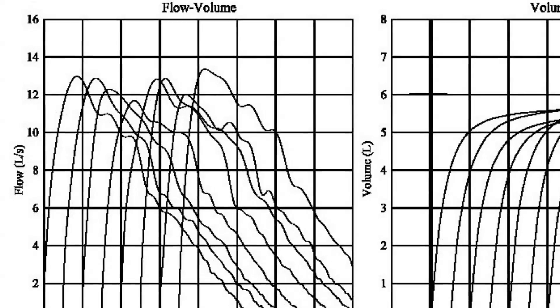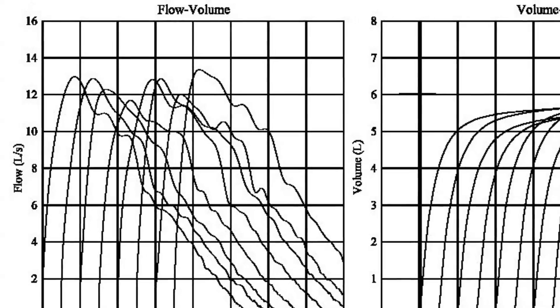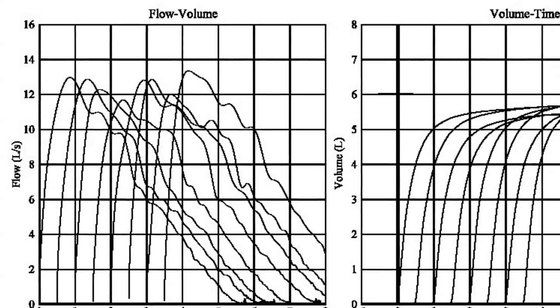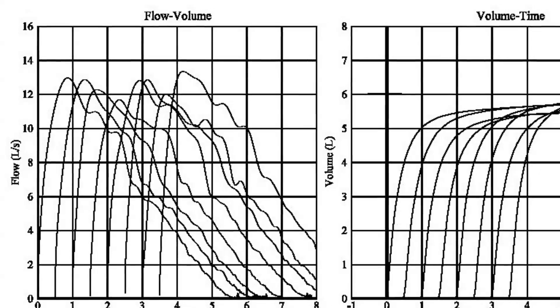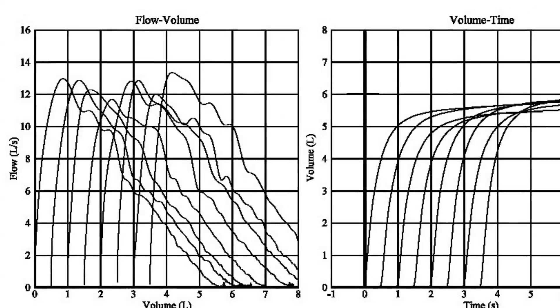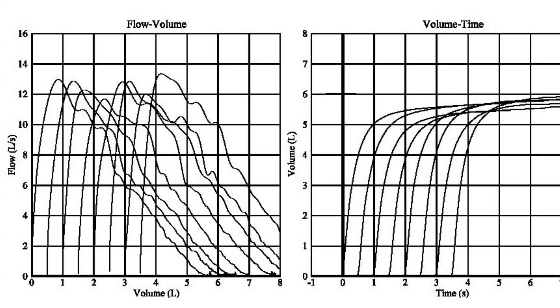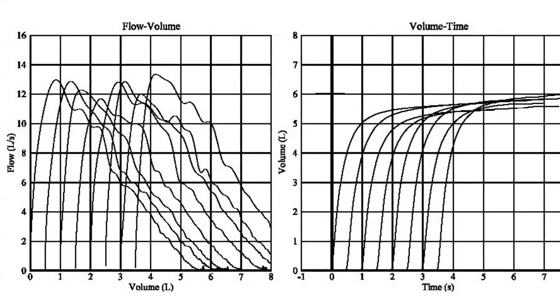But if we offset each maneuver, so that each starts on the graph one second after the last one, it's much easier to see them all individually.